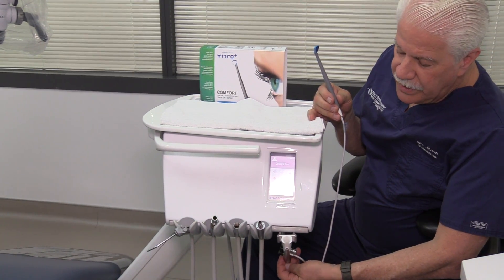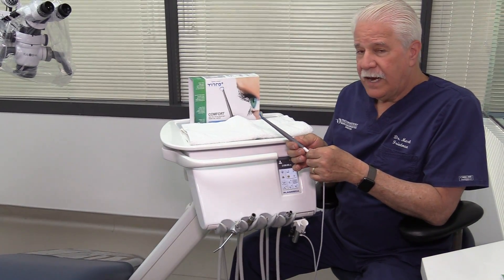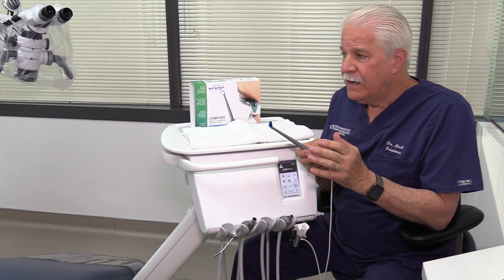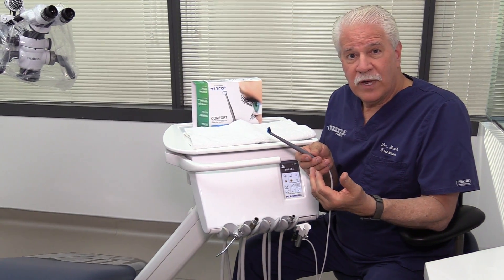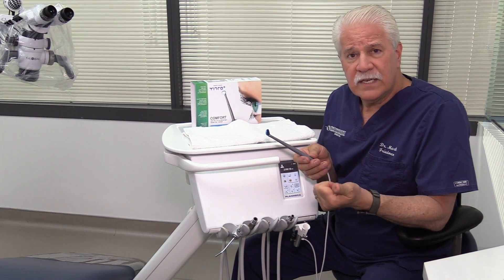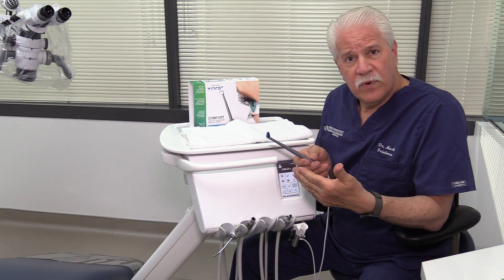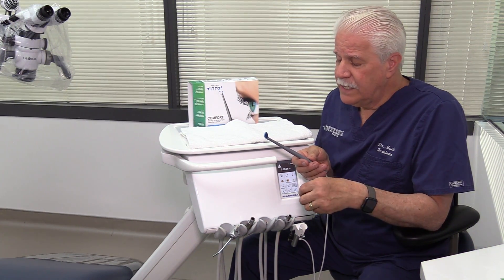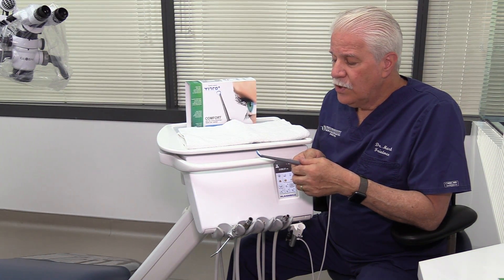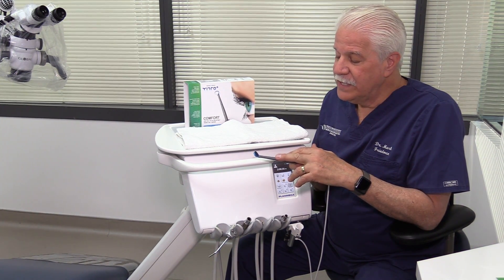One of the important things, of course, is to have adequate water when you're working, especially on a vital tooth. Many dentists have a tendency to cut their water down — especially in the U.S. — because they just can't see what they're doing. And we know that's counterproductive. It allows the instruments to clog, creating more friction, which is not good for efficiency and cutting. More importantly, for a vital tooth, it raises the potential for raising intrapulpal temperature and possibly causing damage to the pulp.